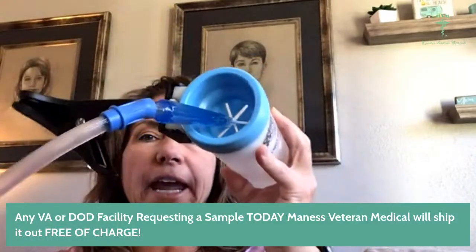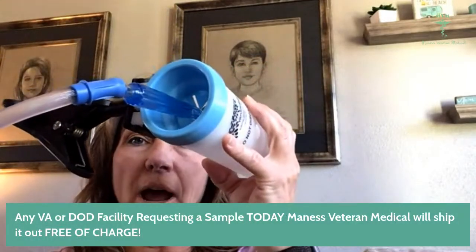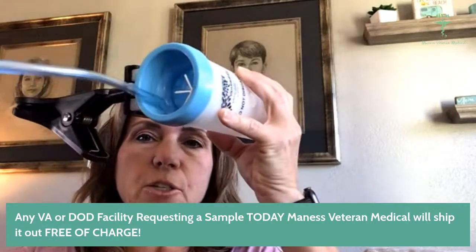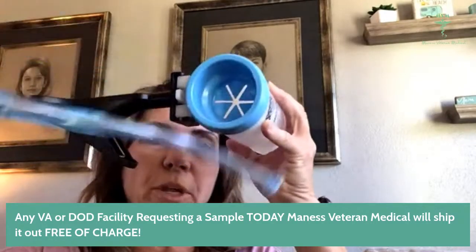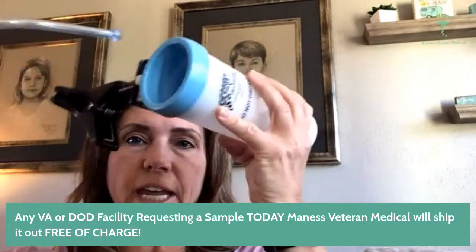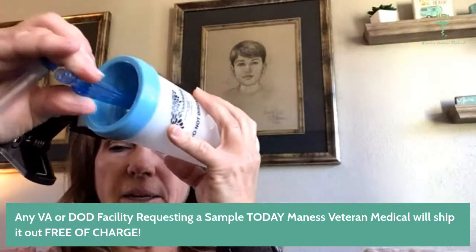Even at this angle, the Yankauer won't just fall out, because the little teeth in there kind of hold it in. But it's also easy to pull out when you need it, and then you just put it right back in. So you use it, take it out on the patient, put it right back in.